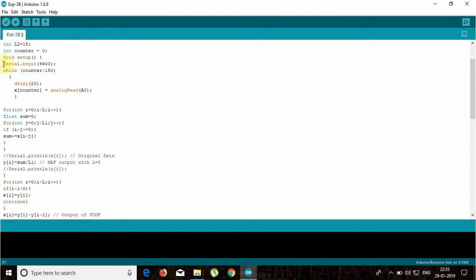Moving on to the code, we begin the serial communication with a baud rate of 9600. In this while loop, we collect the real-time PPG signal data with the help of this command, analogRead. We provide the delay as 20 milliseconds so that the sampling rate will be 50 Hz.